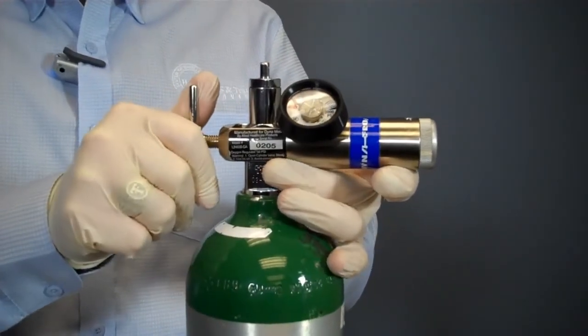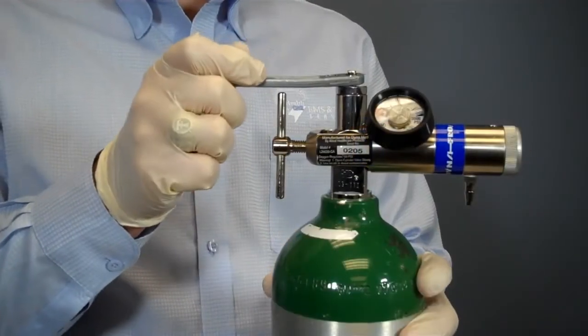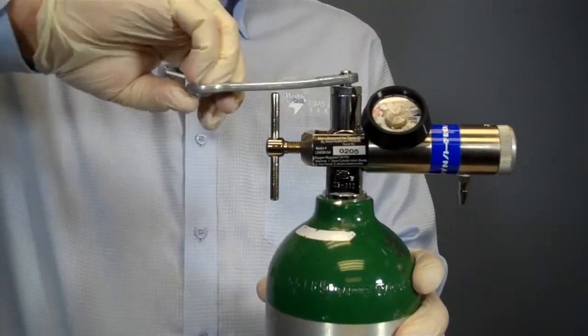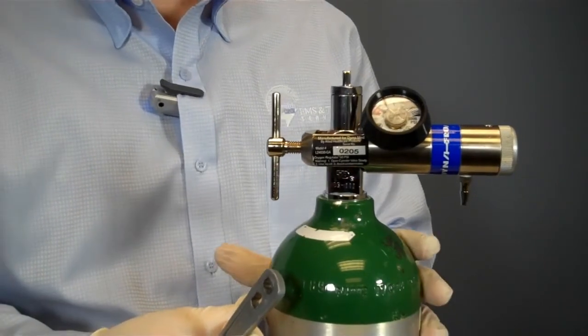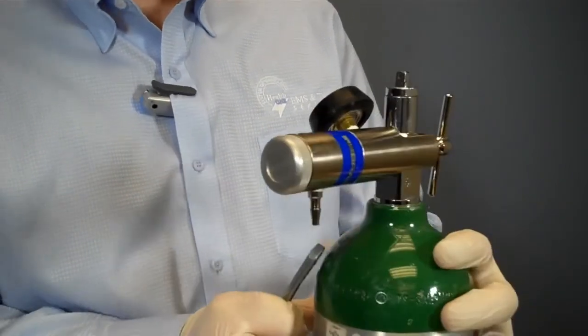I will open the tank valve by turning the key one full turn counterclockwise. Now I will state the pressure in the tank as determined from the reading on the pressure gauge. Finally, I will check to make sure there are no leaks around the regulator.